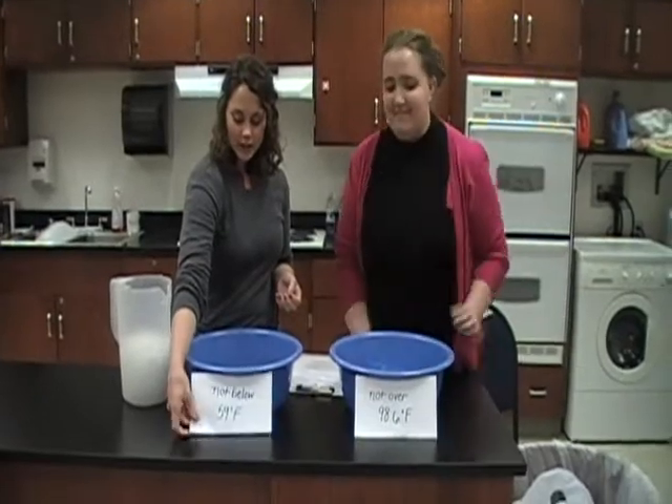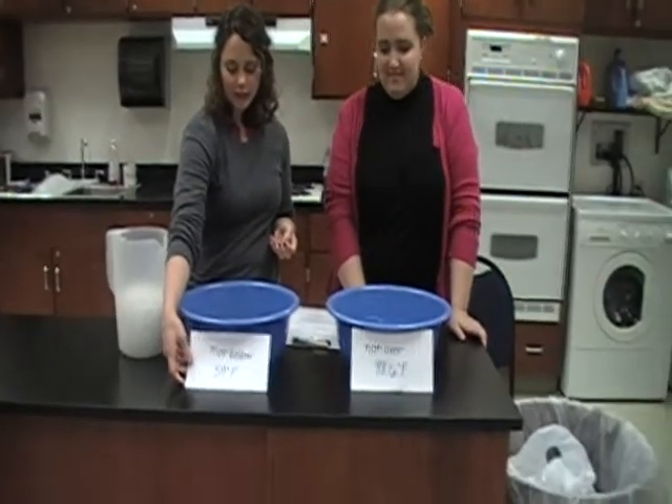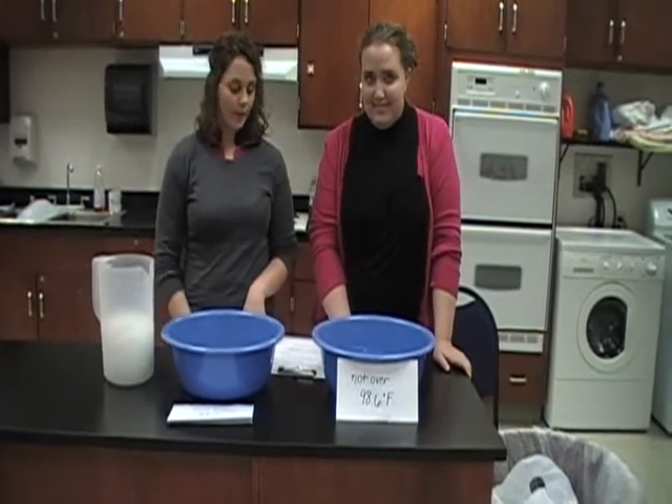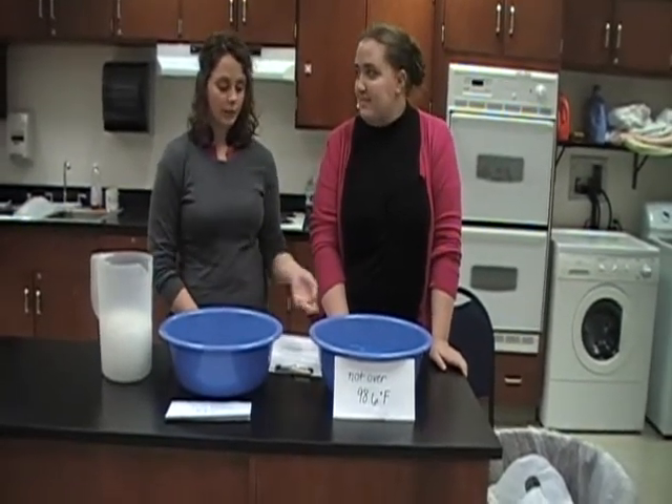The cold water you want to be no colder than 59 degrees, and the warm water should be no warmer than their body temperature, so usually 98.6, but you want to take their temperature to make sure.